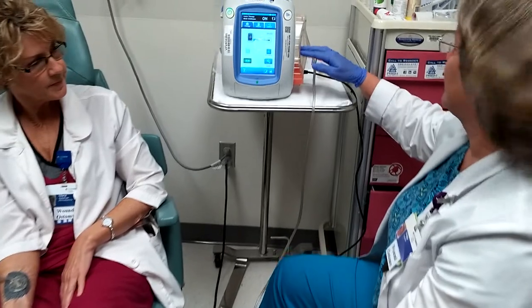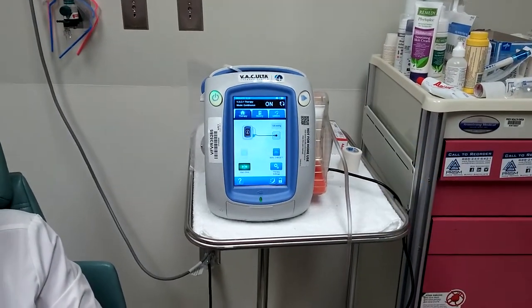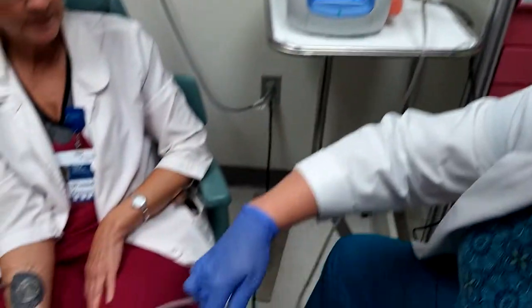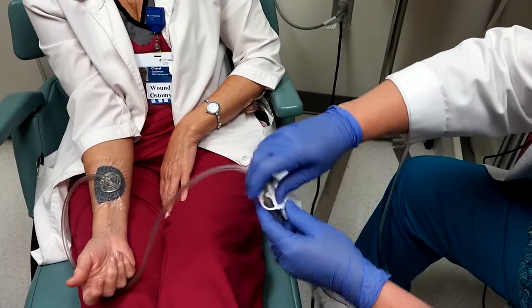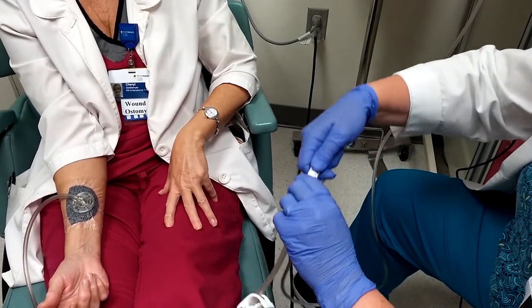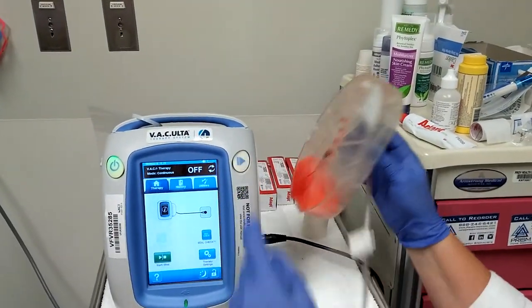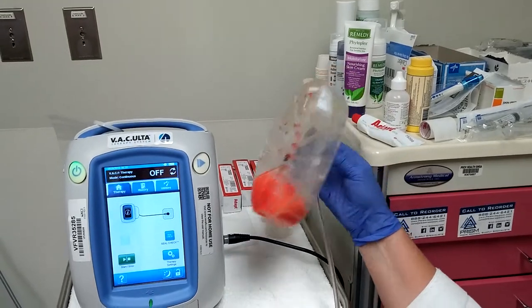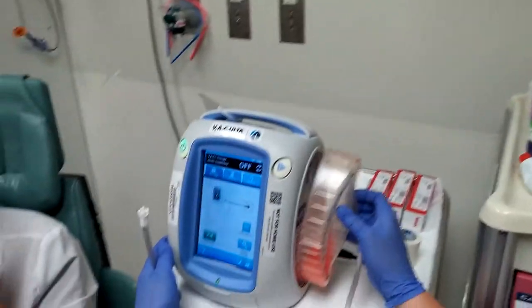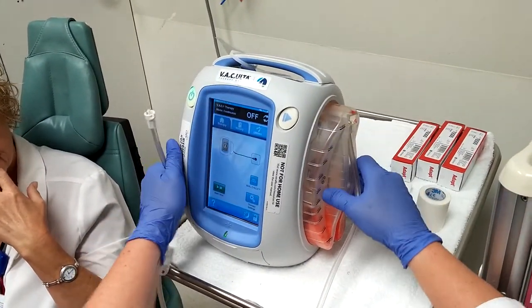When your canister is full — these hold 500cc now, so that's a pretty good volume — go ahead and stop the suction. If you clamp it off, that'll help maintain some of the suction there. Untwist and disconnect. Then push your button and the canister pops out. It has little track grooves that fit right in, so put the new one in and it should kind of click in there.